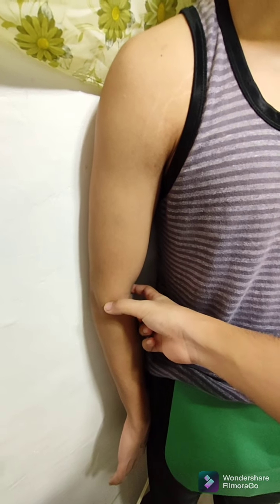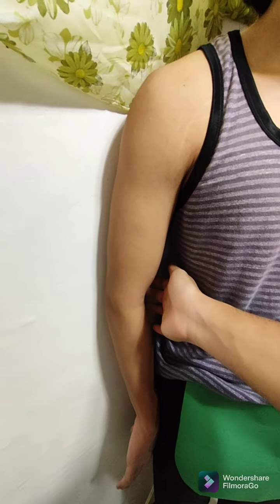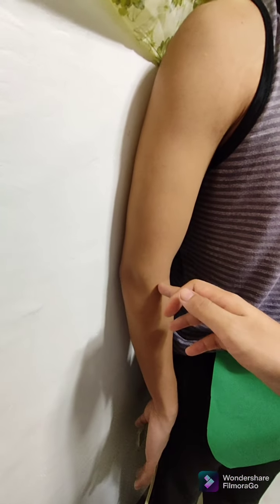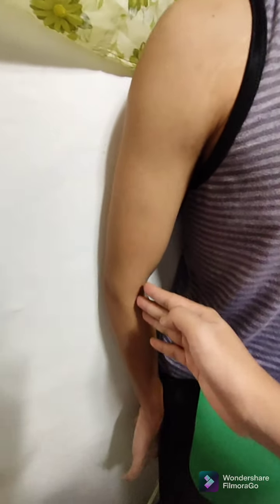May ensure natin na tamang pagka-rotate natin sa limb ng patient is dito siya banda. Itong interepicondylar line dito banda sa humerus, it should be perpendicular against the IR. So may konting rotation pa. Rotate ka po ganyan sir. Then dikit ang shoulder dito. So mas naging perpendicular na ang interepicondylar line dito banda sa humerus against the IR.